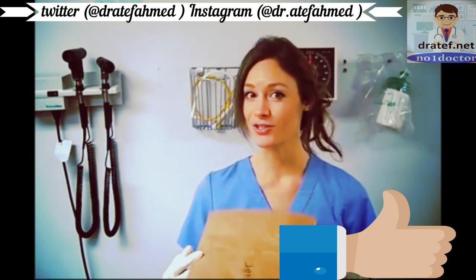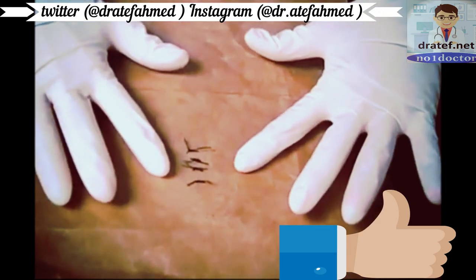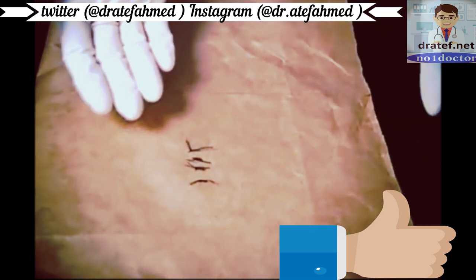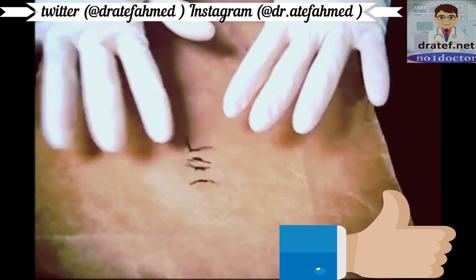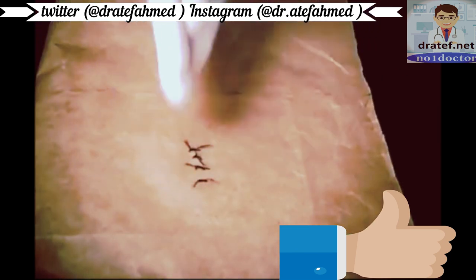I put the sutures on a paper bag so you can see them a little bit better. I put four sutures in and made them a little bit big so hopefully you can see clearly. Before you start, measure the actual incision and make sure there's no excessive redness — it should just be slightly pink and really should be intact.